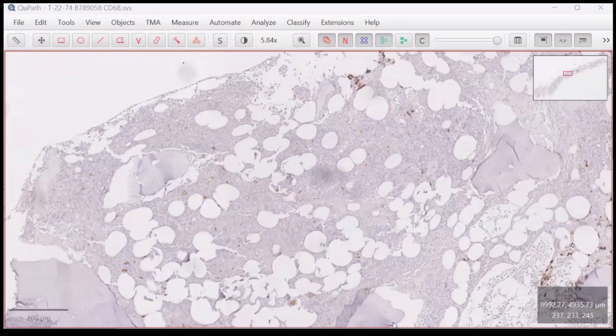Okay, thank you so much, Doctor. That's actually really helpful. So CD163 is for the more immature monocytic precursor, and CD14 is for maturing monocytic series. Yes. Okay, another question, Doctor, from Dr. Farah, regarding CD117 interpretation, particularly on follow-up marrow. Can you share how should we interpret it, as there's always background staining and positivity on the cells with much lesser intensity? How to differentiate whether it is background stain or positive staining cells?